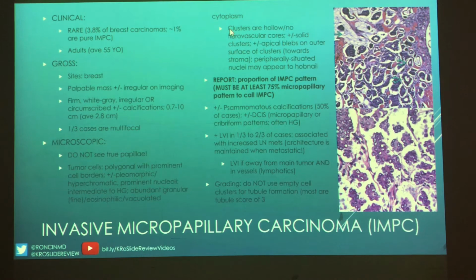That's why it's so important when we're sampling a mastectomy that you make sure you're taking samples in between all the lesions. Because sometimes you can't tell on imaging that they're actually the same lesion. So they'll measure two different lesions, and if we come and tell them, oh no, that's actually one big lesion, then that usually changes the staging.